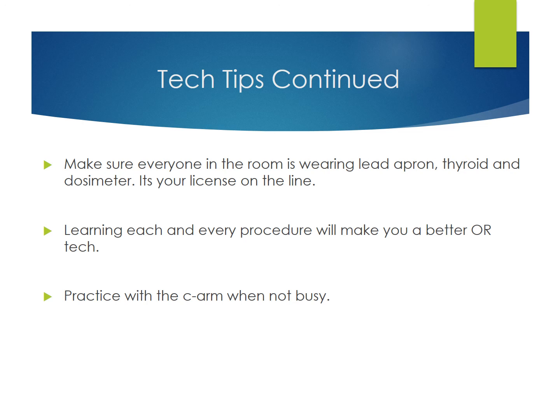Learning each and every procedure will make you a better OR tech. Practice with the C-arm when not busy.